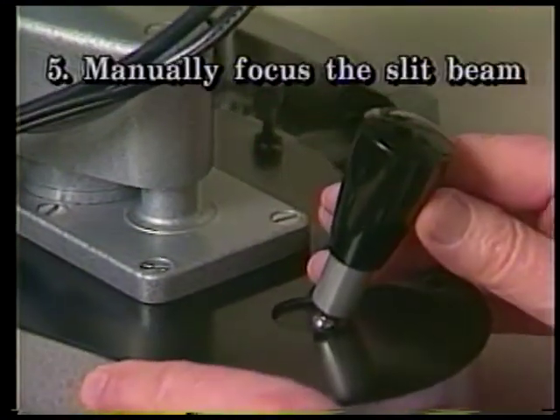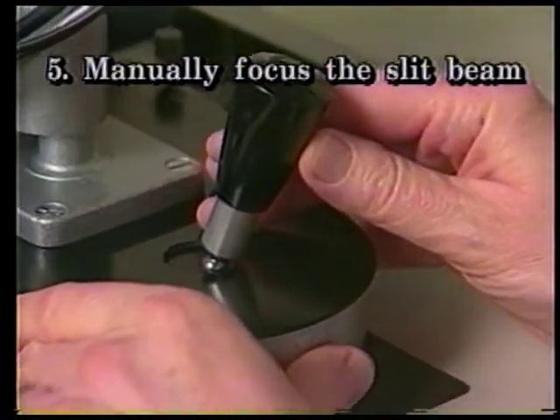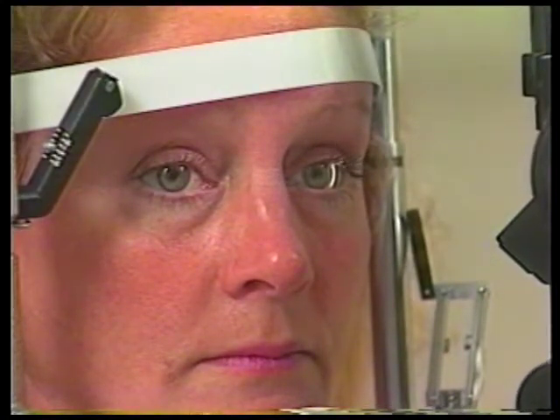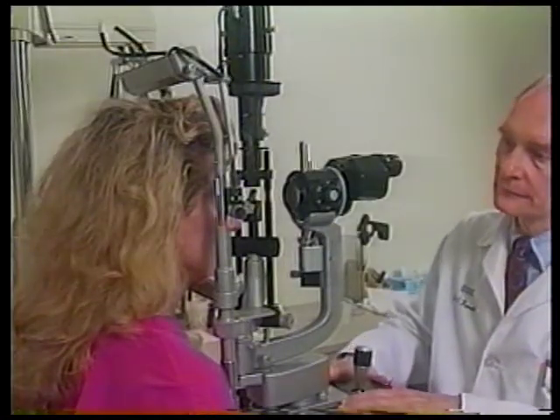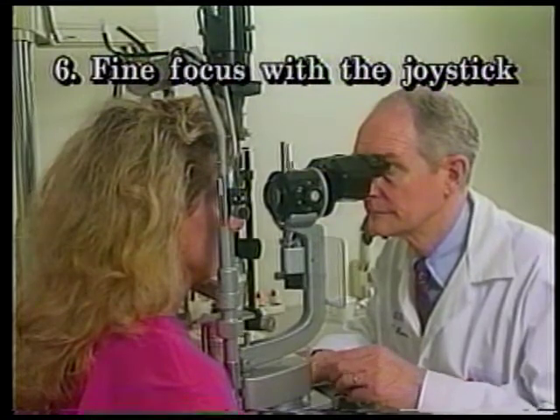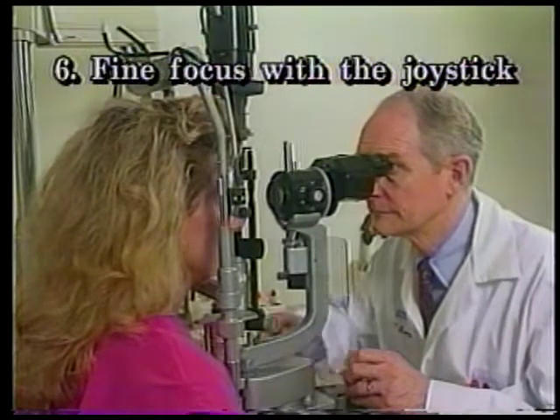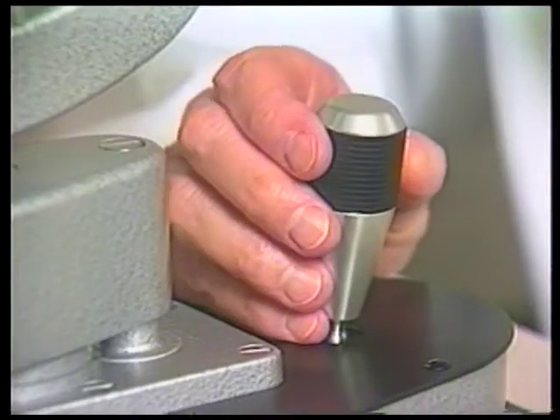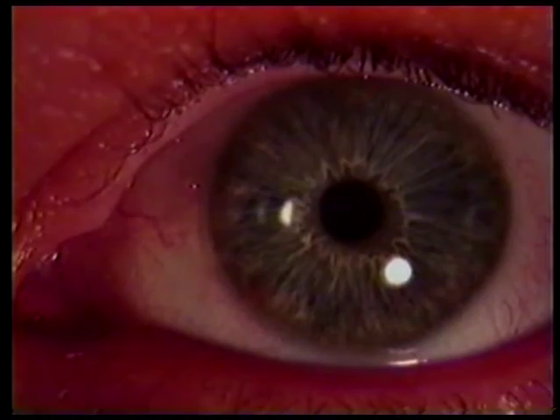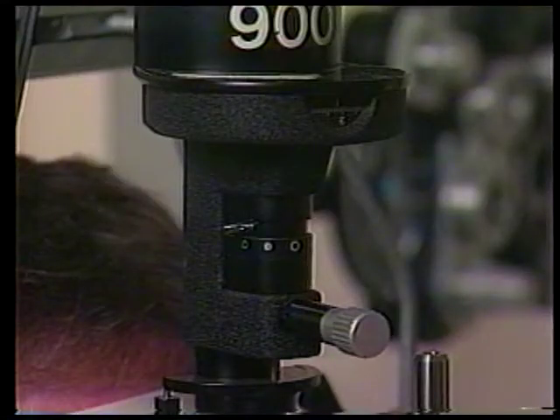Five: grasp the base carriage or cross slide with both hands and move it so the slit beam is focused on the patient's temporal or lateral conjunctiva. This is done with the naked eye and not by looking through the oculars. Now look through the microscope and fine focus the slit beam by maneuvering the joystick. Note that the light beam can be elevated or lowered by twisting or rotating the joystick. To vary the dimensions of the light, the following controls must be adjusted.